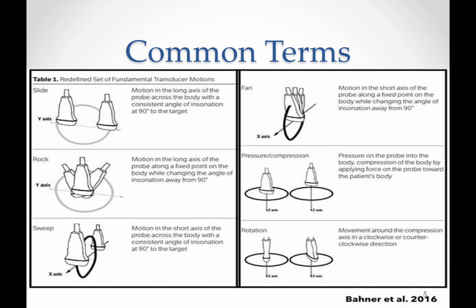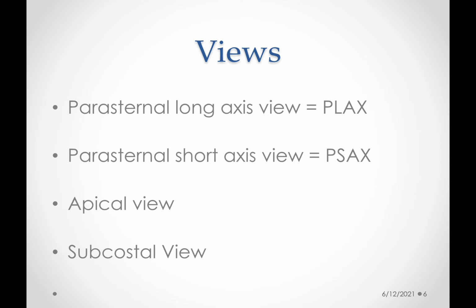These are common terms that we use while doing any type of ultrasound: sliding, rocking, sweeping, fanning, compression, and rotation. We'll talk about 4 basic views, which are parasternal long axis view, parasternal short axis view, apical or 4-chamber view, and subcostal or subxiphoid view.